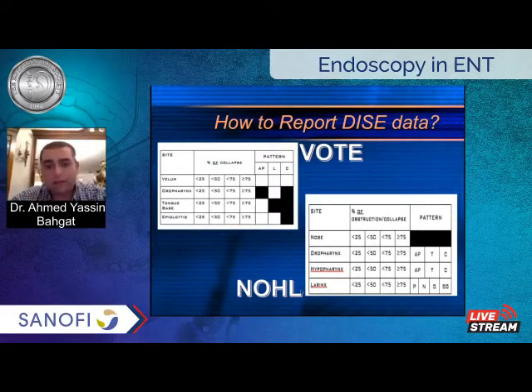The NOHL classification is by Professor Claudio Vicini. I follow this classification. I learned sleep endoscopy from Professor Claudio Vicini, who invented this classification. It includes the nose.